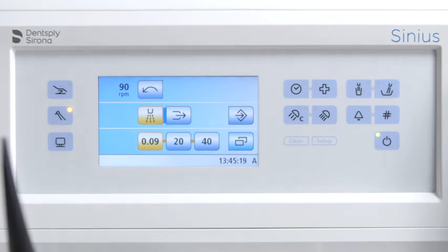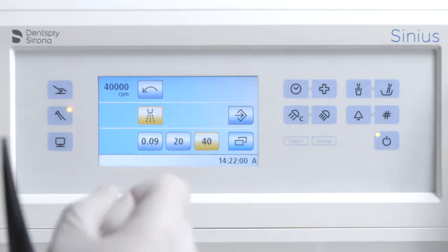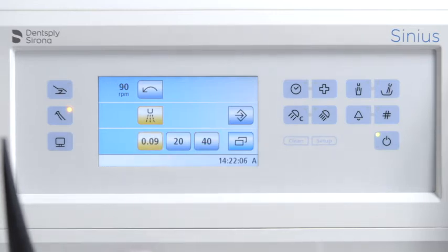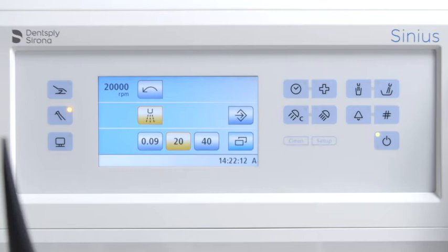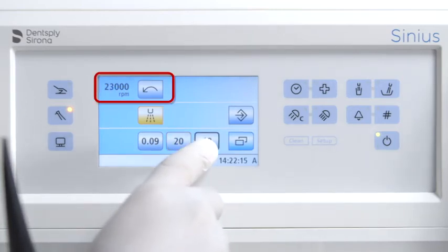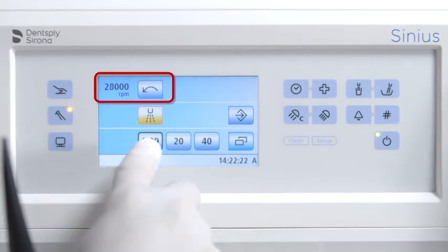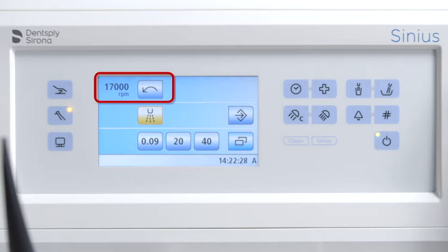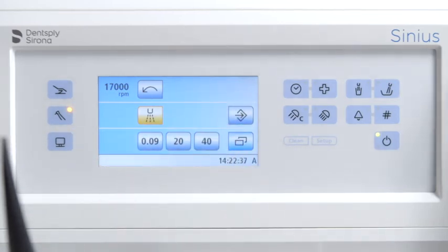When the instrument is removed, you can make the following changes. The values shown on the quick setting keys can be selected by touching them briefly. You can set preset speed or intermediate values using the speed quick setting keys. Increase intensity by pressing and holding a quick setting key for more than one second whose intensity value is greater than or equal to the value displayed in the first line. Note that the settings made are saved only if the save button is held for longer than two seconds after the instrument is deposited.